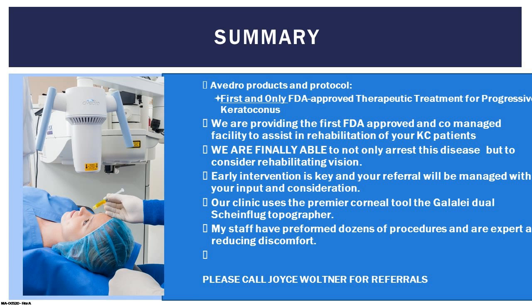It also may well be the future of corneal cross-linking, that we can actually place a shape on the cornea, kind of mold a shape onto the cornea, and then cross-link that molded shape into place. That is very interesting, and there are studies progressing to see if that's a possible way that we can improve vision via this single method. Very exciting work, and we're very excited to be the first center in the Chicagoland area to be providing this kind of direction and leadership.